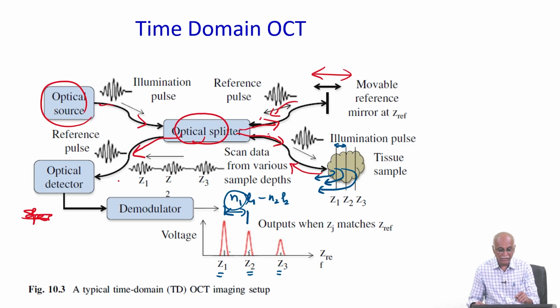Now, if we see in terms of optical fiber based also, it is possible to couple the light through optical fiber and bring it to the sample. Of course, some applications may not need such arrangements, but there are some applications related to dermatology or endoscopy, etc., where we would like to incorporate the OCT approach as well.